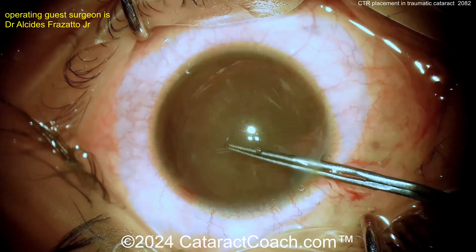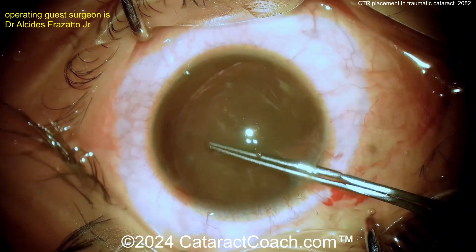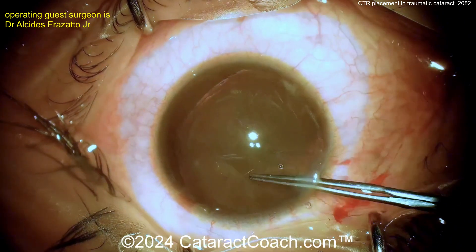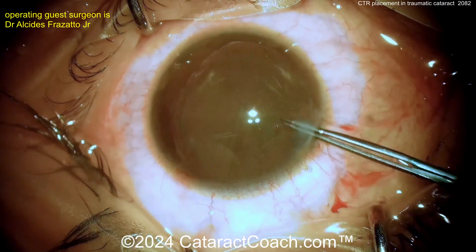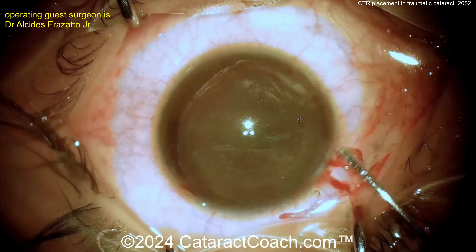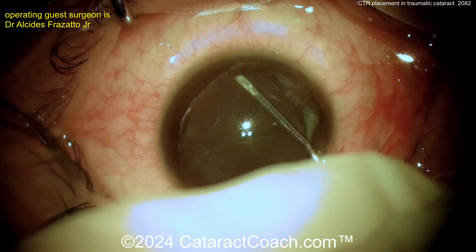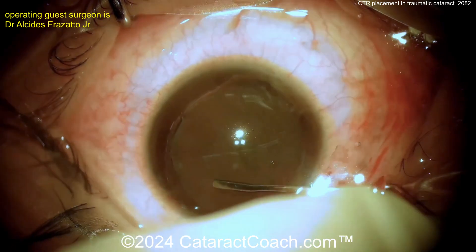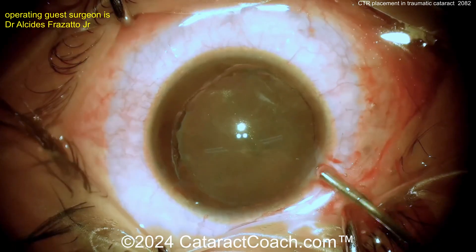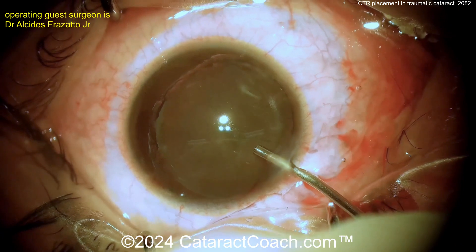As the surgeon's getting the rhexis completed, there's a little bit of laxity in the anterior lens capsule. Completing that rhexis — that looks pretty good. And now loosening up the cataract a little bit, with a little bit of hydrodissection.